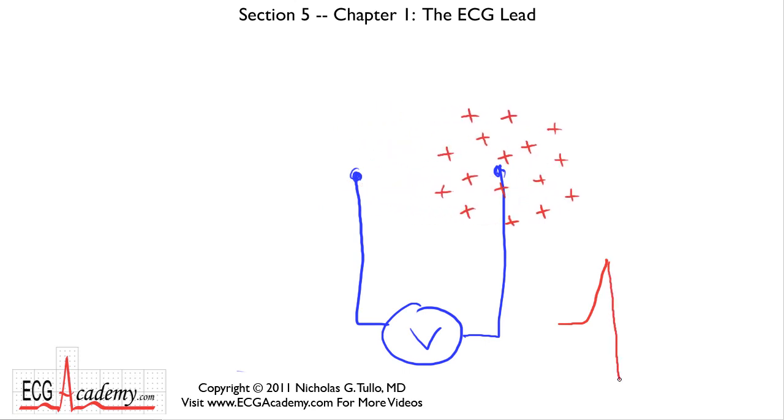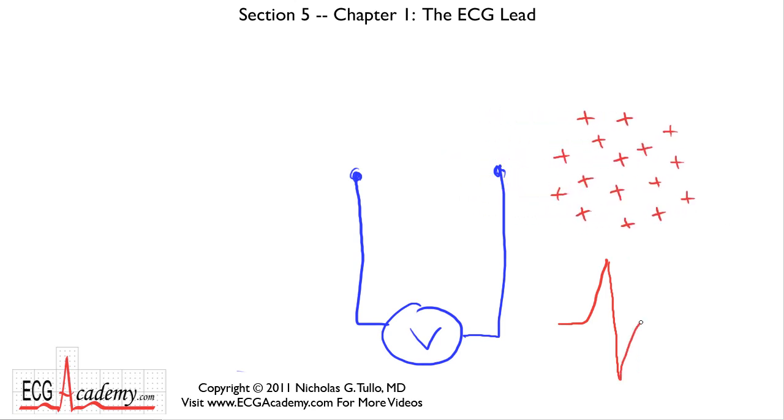a change in the polarity. And then as the signal continues to move, the recording will go back to the baseline state.